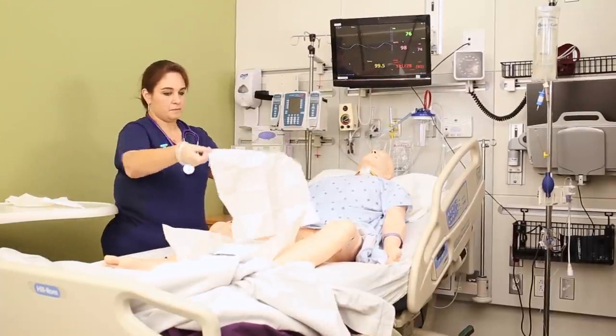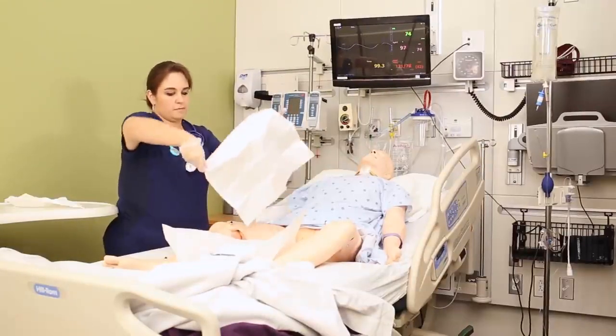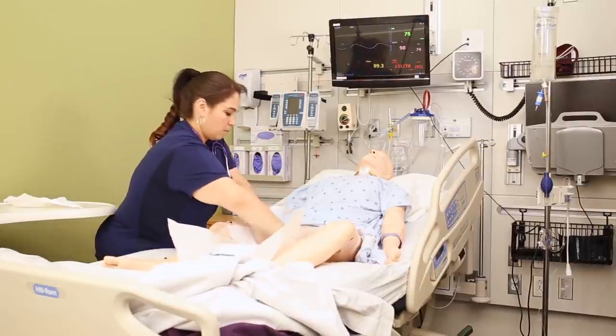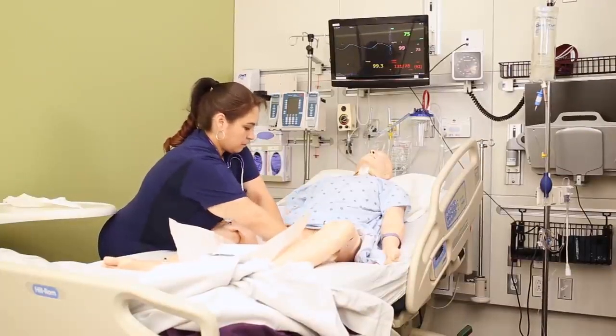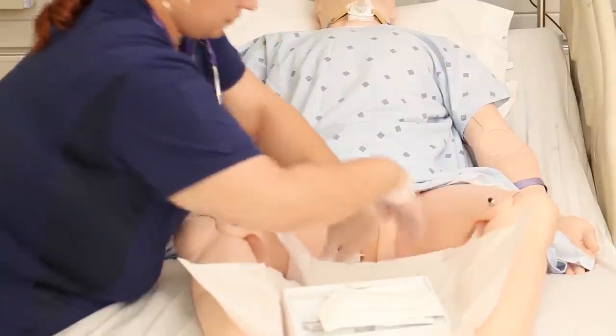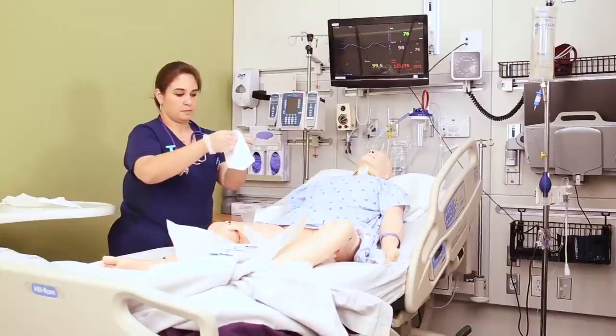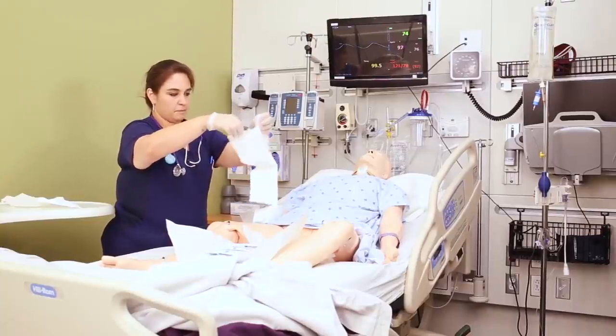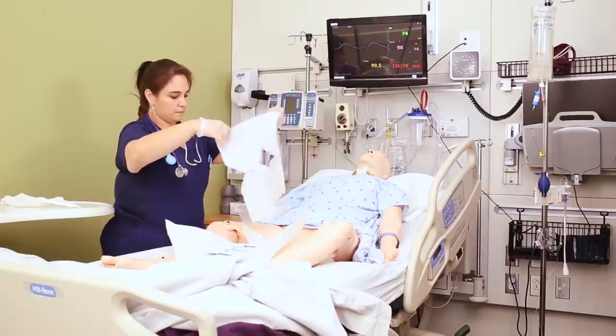Once you have your gloves on, grab the full drape and carefully place it under the patient's perineum, shiny side down. The tricky part is your hands shouldn't touch the patient or the sheets — wrap your hands up in the drape and tuck it in so your hands are only ever touching the drape. Then grab the fenestrated drape — the drape with the hole in it — and place it over the patient's perineum gently without touching the patient's skin.